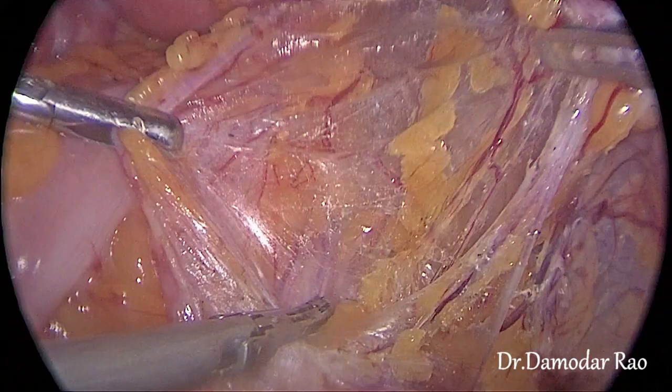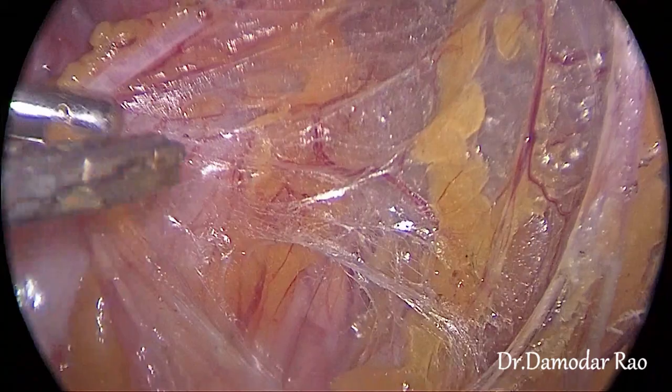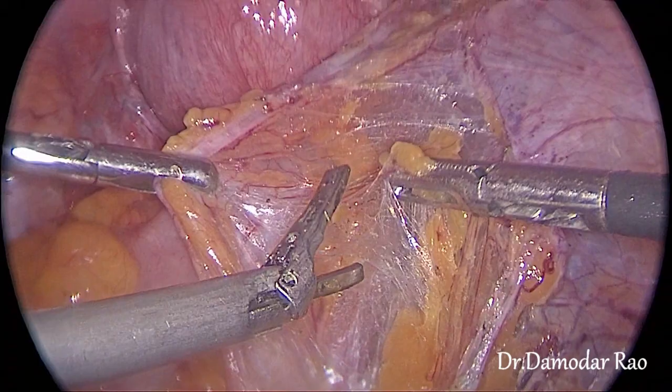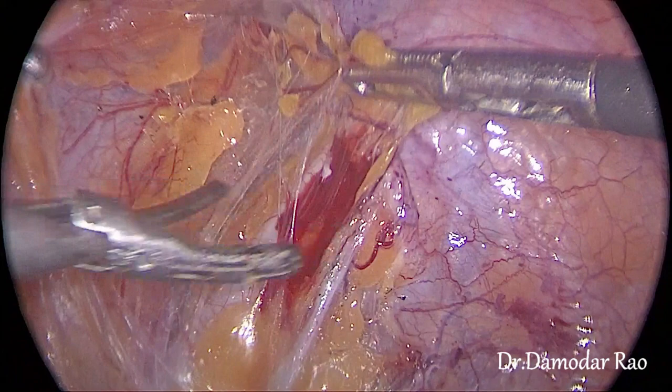Here I have dissected this space with a harmonic from the round ligament back up to the pelvic brim, usually parallel to the IP ligament. What is important here is the medial pull I give on the IP ligament that exposes the ureter. Next we have to cut these transverse fibers.